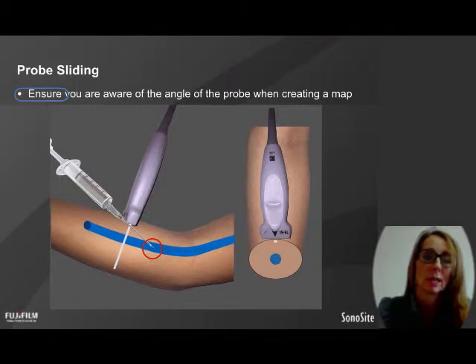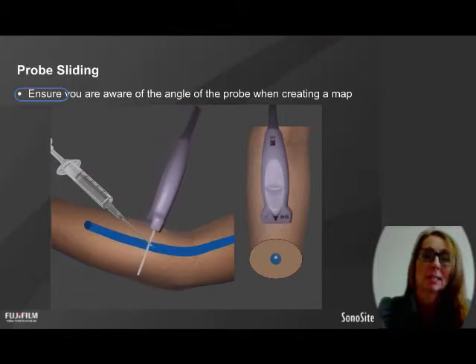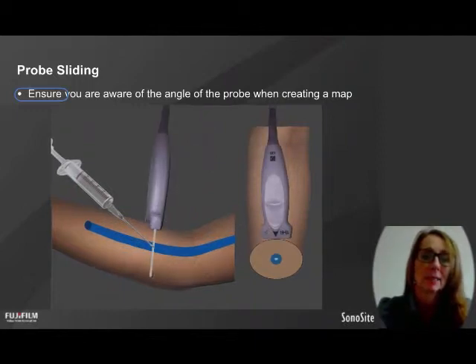I've seen that a lot, where the staff member is saying to me, but it's not in the vessel yet, and the patient's going, ow, ow. And when you move and tilt it correctly, you realise that they're actually poking it back out the other side, down on the bottom. So you can see here now that the change in the tilt has got it in the correct place.